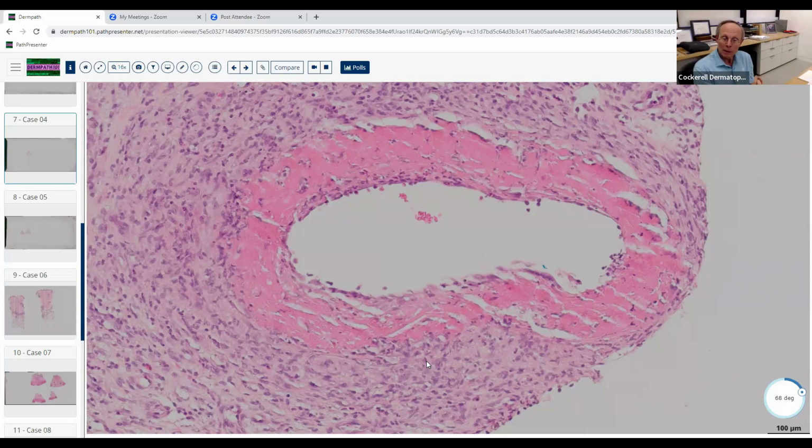Wegener's, Churg-Strauss, and then lymphomatoid granulomatosis is another one that can give you a granulomatous vasculitis, and sometimes temporal arteritis. And then infectious diseases can sometimes give you a granulomatous vasculitis. So those can involve fairly large blood vessels as well. So that's it. There's really not too many. The good news is if you see really bona fide granulomatous vasculitis, where there's vasculitis with definitive granulomatous inflammation, you can narrow the diagnosis down pretty quickly to one of those few entities.